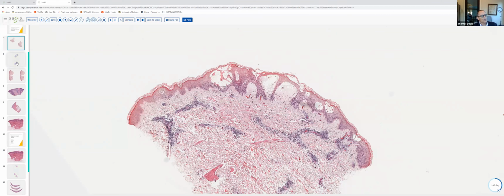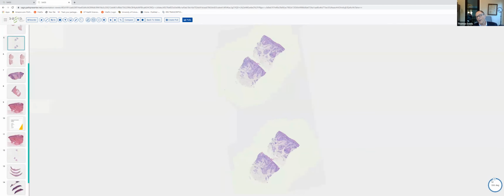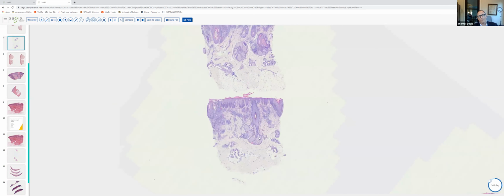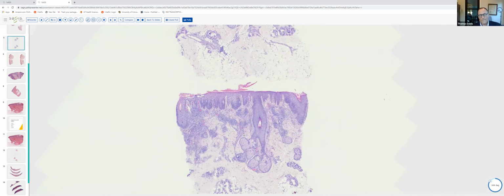Moving on to slide 2. Slide 2 was an example of a subacute spongiotic dermatitis. This could be either subacute or subacute to chronic spongiotic dermatitis. Well, what do we see clinically in such lesions? Well, in subacute lesions of contact dermatitis, these are later than the case that we looked at in slide number 1. And what happens with these lesions over time?